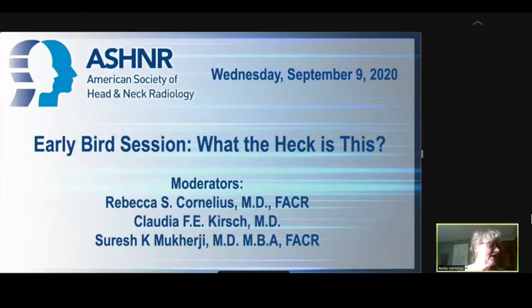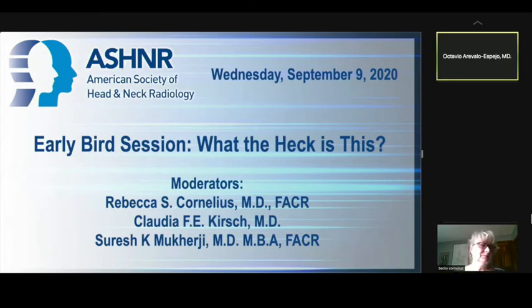Thank you, Octavio. That's a very interesting case. Are you on the line here this morning? Yes, good morning. Thank you very much. You're welcome. And again, so this patient, this was his initial presentation, correct? Yes, doctor. This was his initial presentation. He was otherwise healthy. He was a 36-year-old, 37-year-old. Okay. It was the single lesion the patient had.